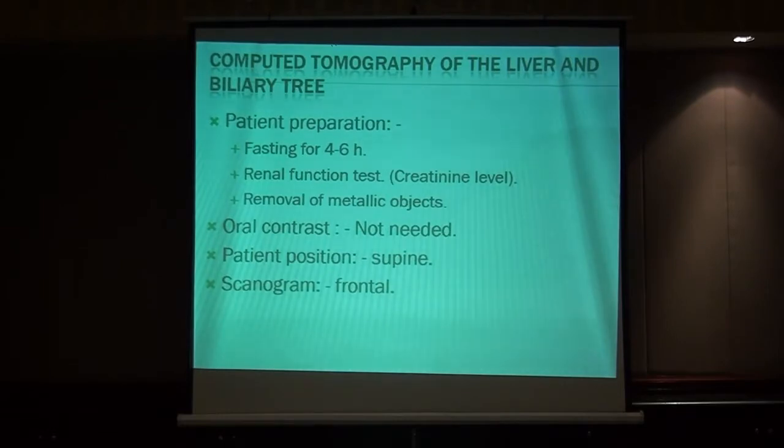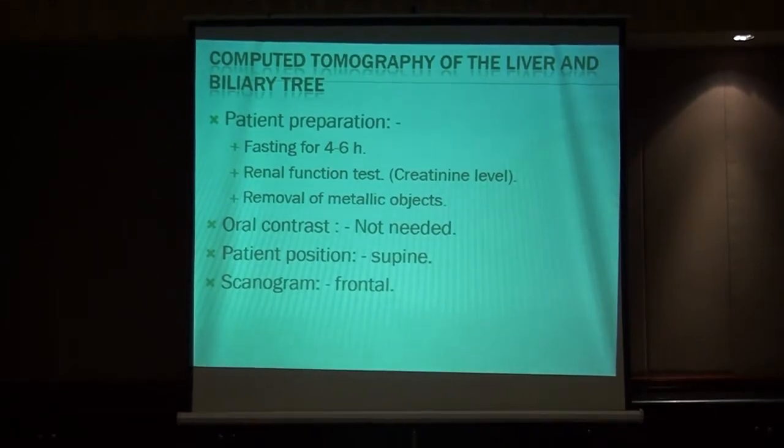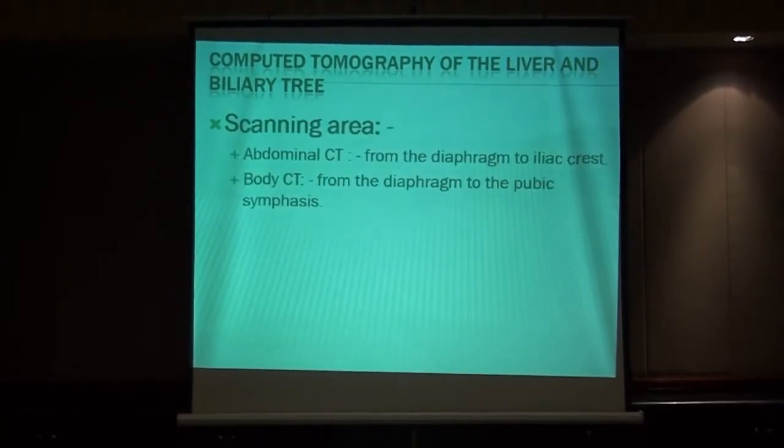The patient should be fasting for 4 to 6 hours. Renal function tests should be normal. Removal of any metallic objects. No oral contrast is needed. Patient position is supine and scannogram frontal.